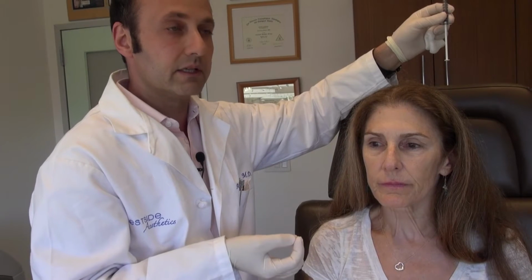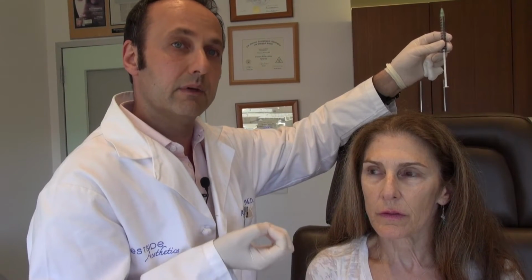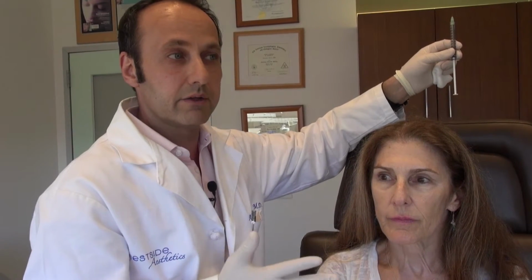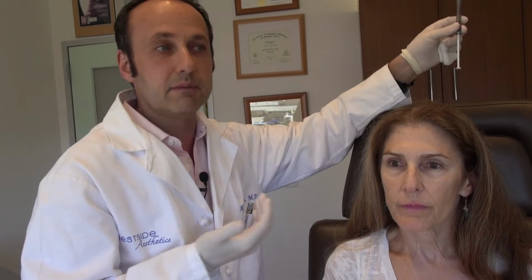Over years of injecting the tear trough, I noticed that very clearly the tear trough is a privileged area. It's an area that holds on to filler, no matter what the filler is, for a very long period of time. When I inject hyaluronic acid, at first I started with Juvederm, and then I've tried others. But when I inject hyaluronic acid into the area, it lasts for a very long time. Full strength Juvederm, I've seen people come back 6 years later and they still have that fill. I tried other ones like Restylane and Belotero, and I'm not quite sure they're going to have the same kind of duration.